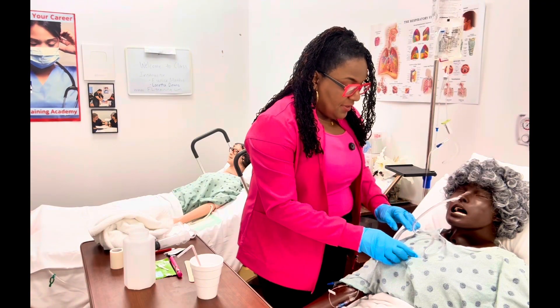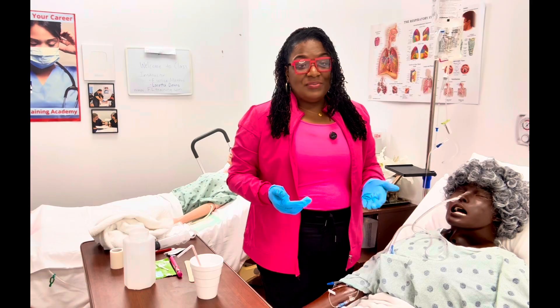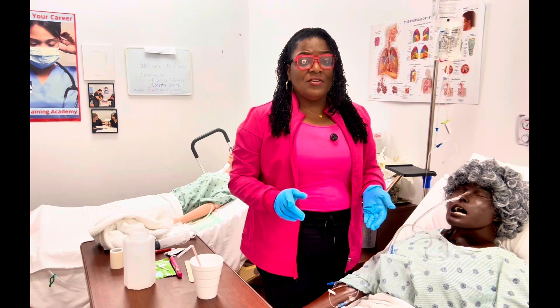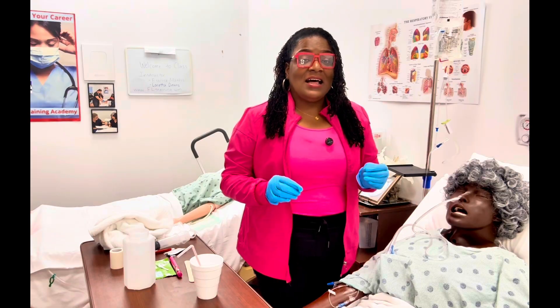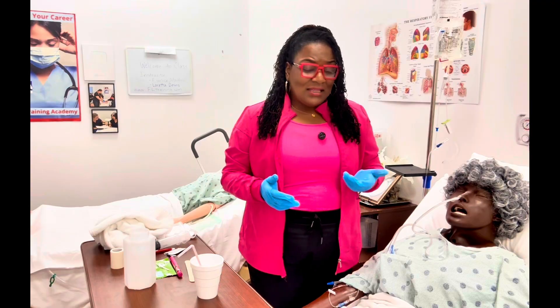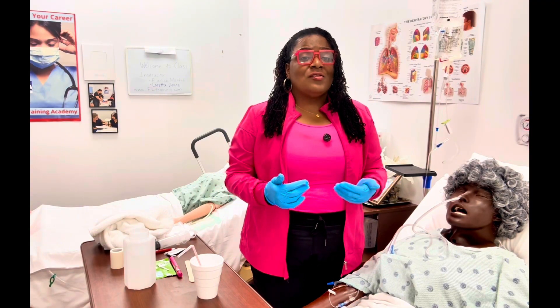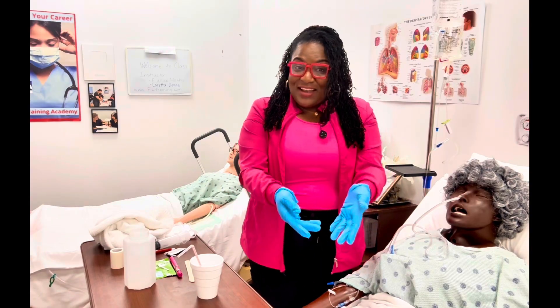Your facility may ask that you pin the tube to the patient's shirt — I'm going to tuck it in the pocket of her shirt for now. That's how you insert a nasal gastric tube. Remember: use pH strips as a preliminary check, but you must have an x-ray to confirm placement. If your patient starts having any respiratory issues, that could mean the tube is not in the right place — assess your patient, listen to lung sounds and bowel sounds, and ask about their pain.